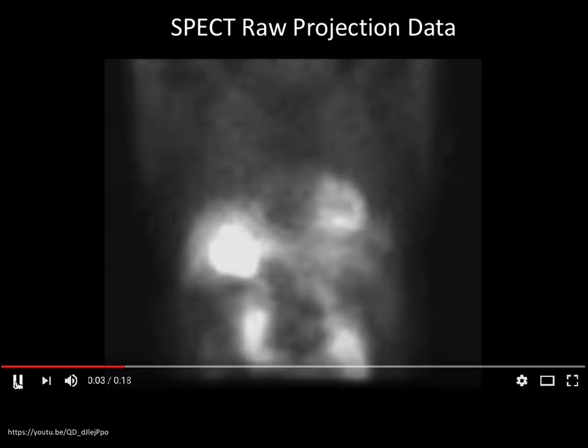If all you're doing is detecting whether or not this contrast agent gets accumulated, say in an organ or a metastatic tumor, oftentimes in cancer you don't really care how closely you can measure where that metastatic tumor is. You care about, does it exist or not?